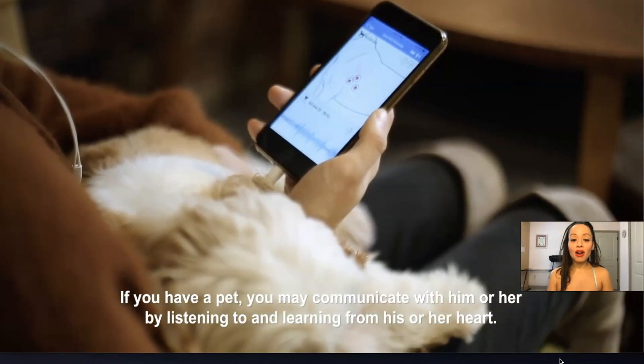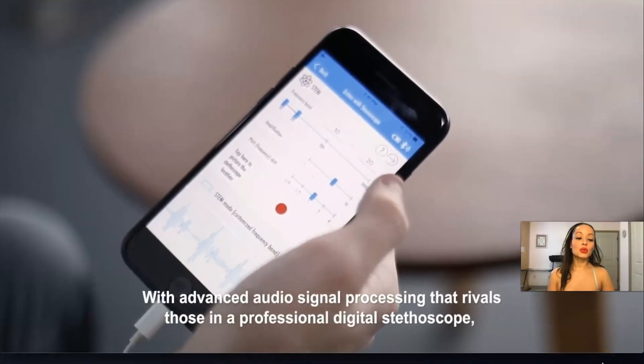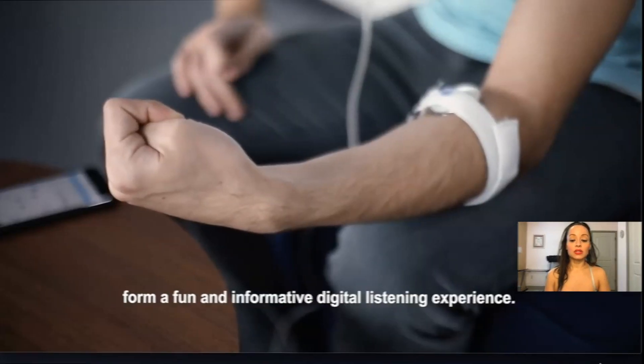You can even listen to your dog's heartbeat — look at that, isn't that adorable? I was really impressed by the sound quality of this stethoscope. It really does play amazing sounds.